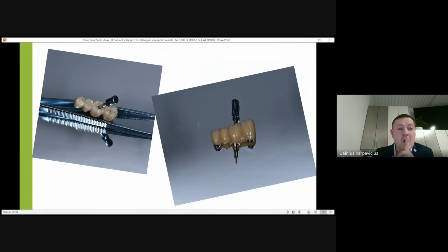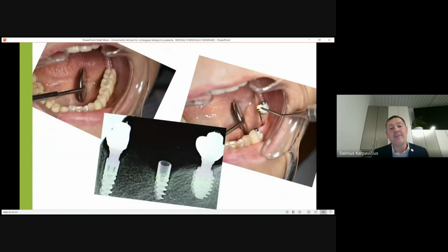This middle implant has no conometric. It has a T-base because a couple of years ago we had thinner soft tissues and we couldn't use conometric on top. Maybe it was my mistake, and maybe I didn't submerge the implant enough. Maybe it was the cause of the patient's mouth, how it influenced this part.